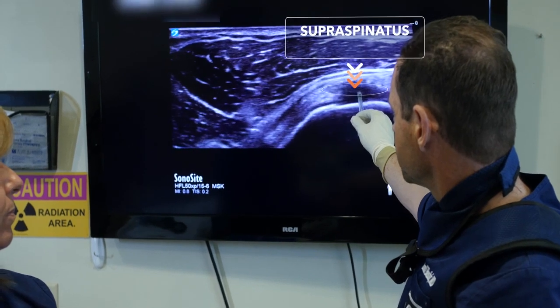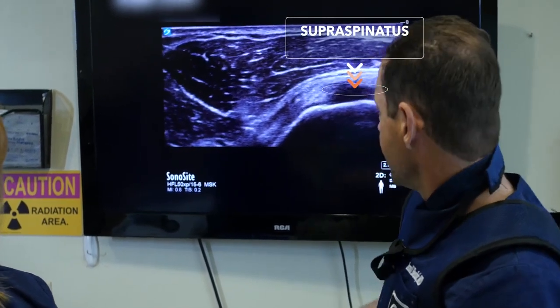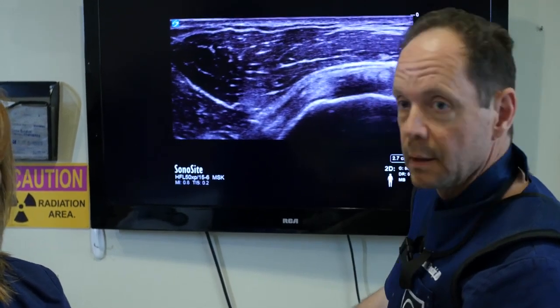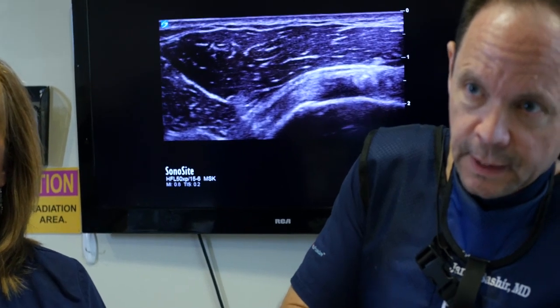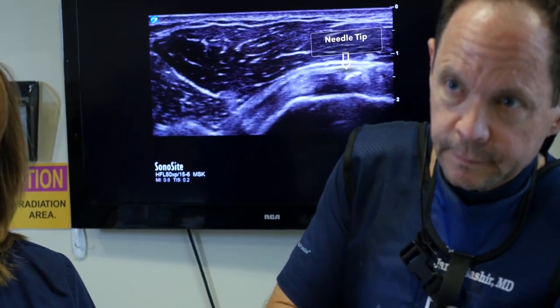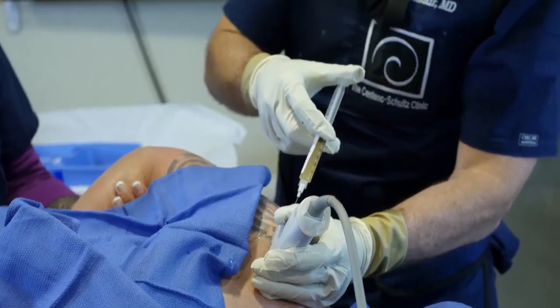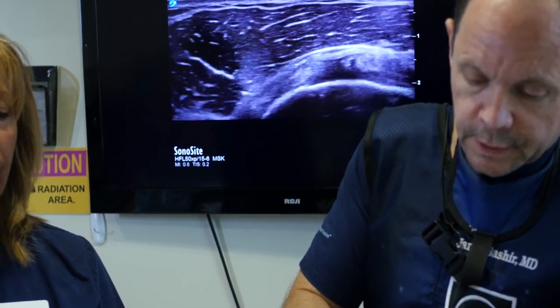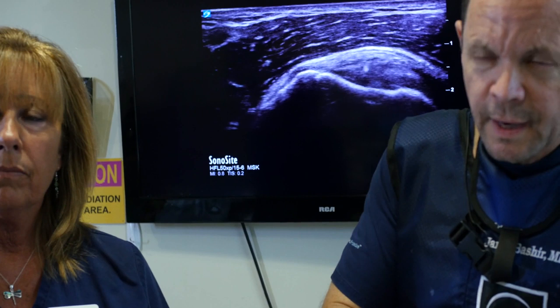Now we're addressing the defect in the supraspinatus. The only way to get into this specific area, this specific defect, is under guidance. We're now seeing the needle tip into the defect. We're going to inject a small amount of fluid, and you can see the distension of the tissue. Now we're changing the orientation and we can see the needle tip — see how it distends right there? So we know it's a partial tear, which was not evident before — notice how it distended.